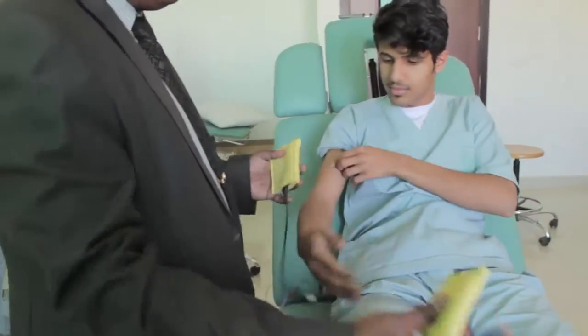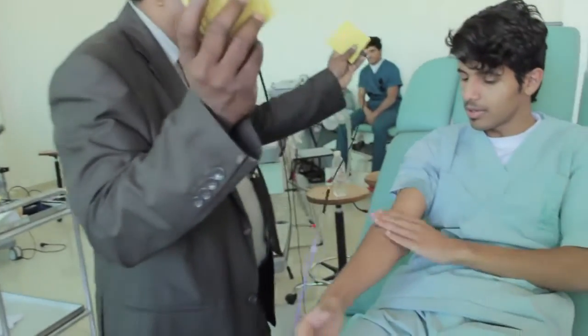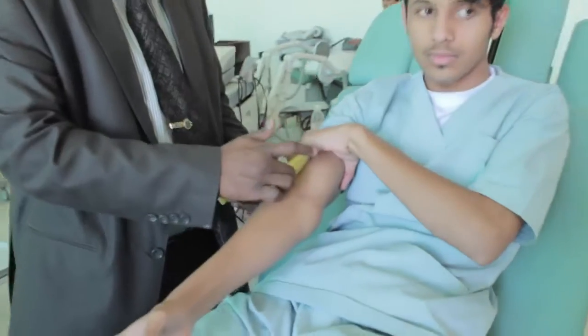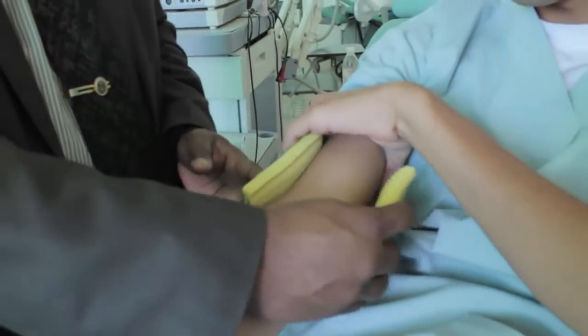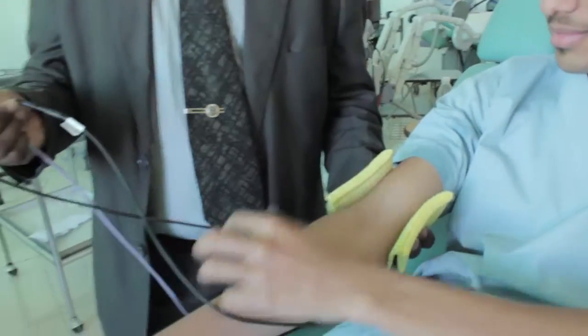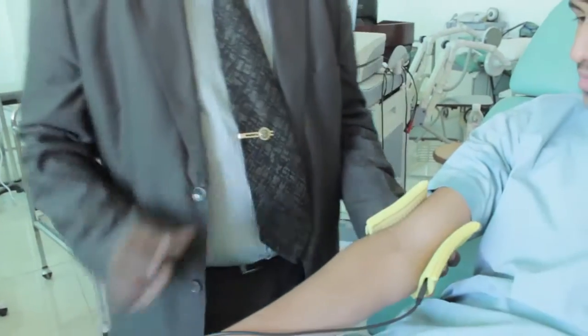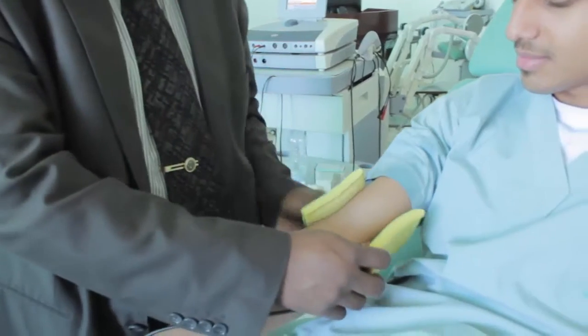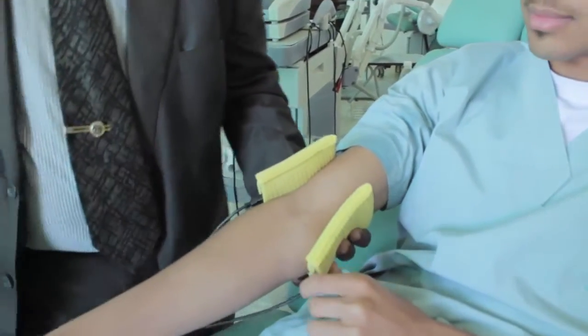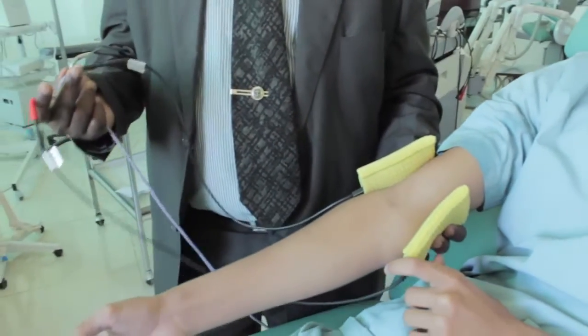Similarly, Shabab, please study from the video. You may not get immediately. Tennis elbow. If it is the tennis elbow, on the lateral epicondyle of the elbow and on the medial epicondyle. On the lateral epicondyle, anode. Medial epicondyle, cathode. Now, if it is golfer's elbow, it is opposite. On the medial epicondyle, anode, and the lateral epicondyle, cathode.